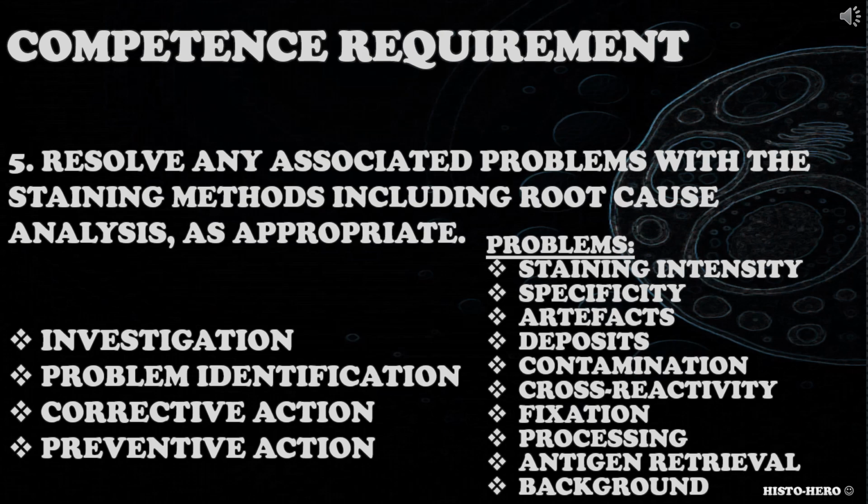Consider possible problems like poor staining intensity, poor specificity of staining, artifacts like uneven staining, hazy slides, presence of deposits or precipitate on the slide, reagent contamination, effects of fixation, processing and retrieval on quality of IHC staining, nonspecific staining, background, absent staining, cross-reactivity.